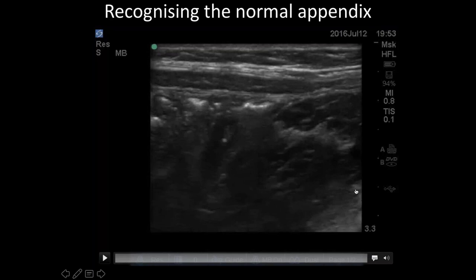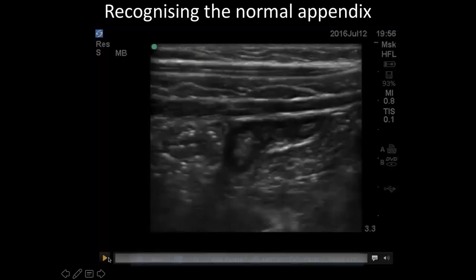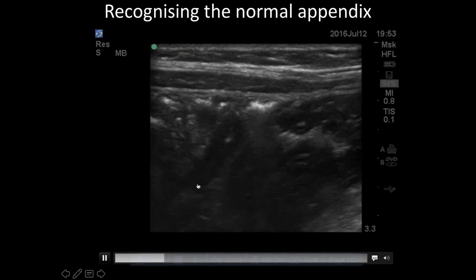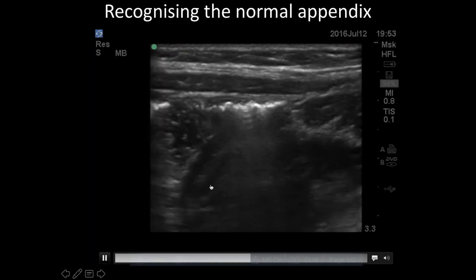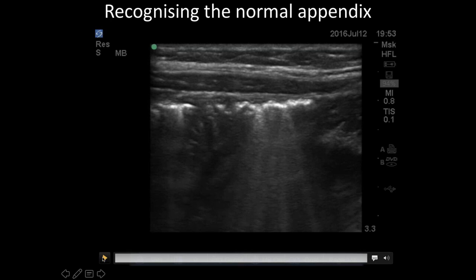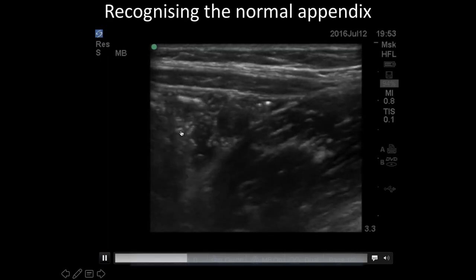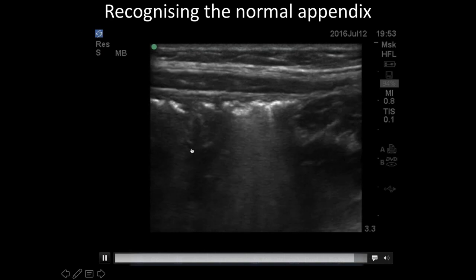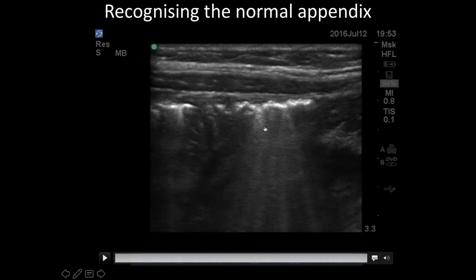This is going to be the psoas muscle here on the right side. I'm going to go back there and play that, and you can see how it pops in with graded compression and fanning. It is more apparent there, and adjacent to it is the cecum and small bowel. There's some peristalsis going on, so there must be small bowel there. And again, this is all shadowing that's obscuring the view.